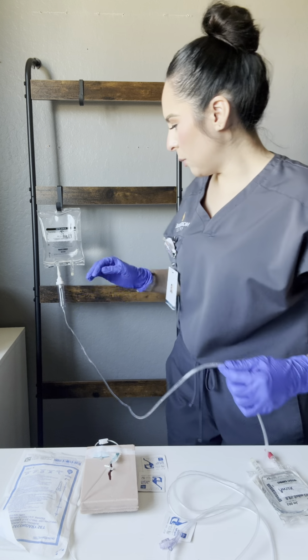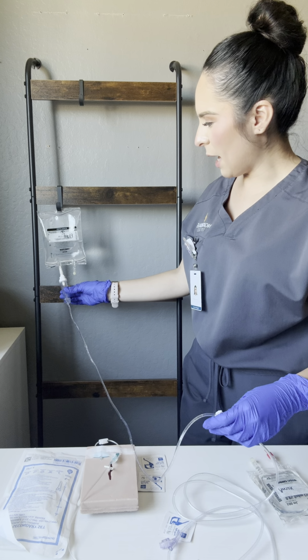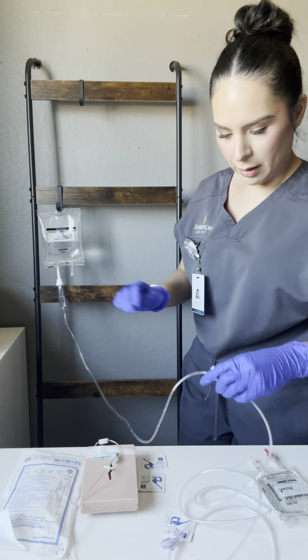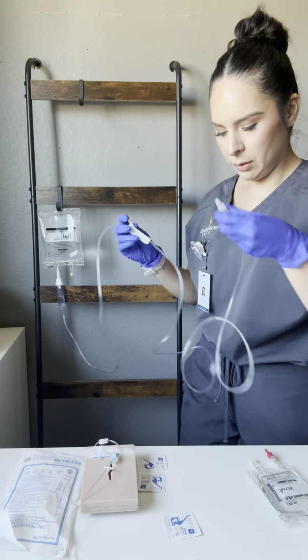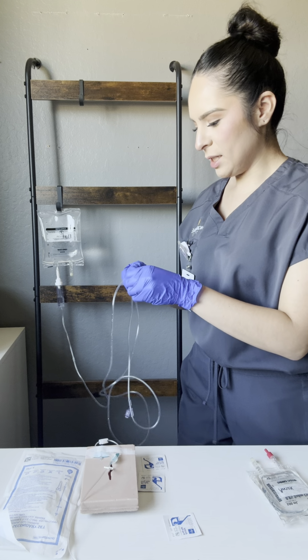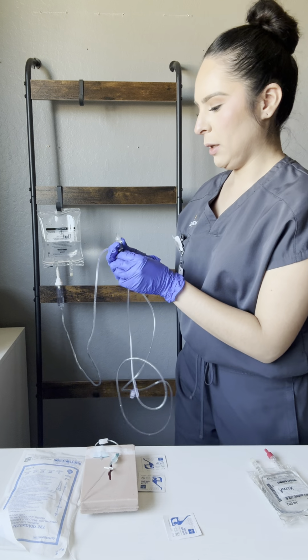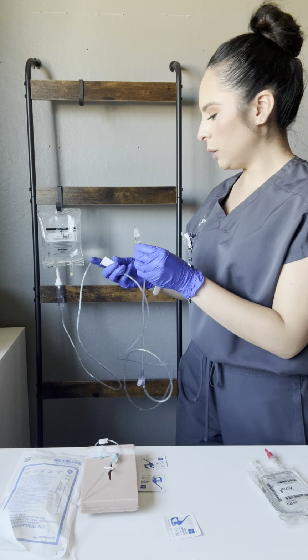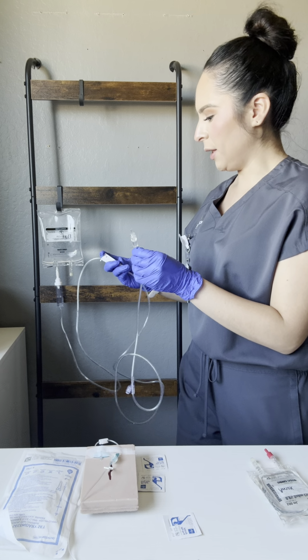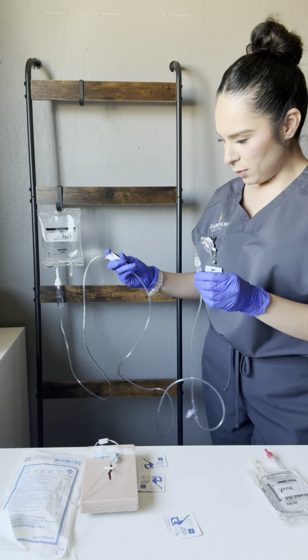And then I'm going to gently squeeze the drip chamber to fill it at least halfway with fluid. And then I'm going to remove the end cap from the adapter end. And then I'm going to slowly prime my tubing by slowly rolling up on the roller clamp and ensure that there are no air bubbles.